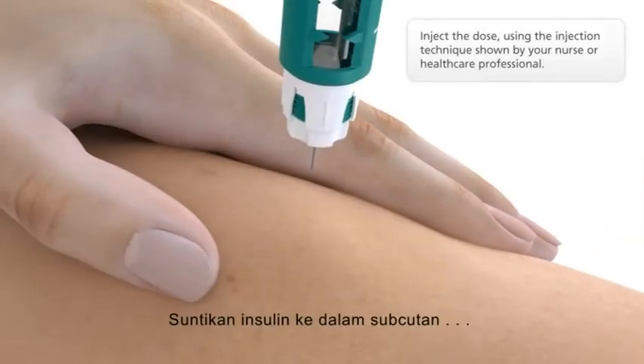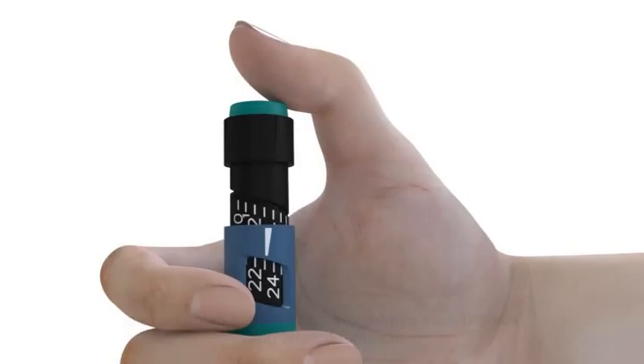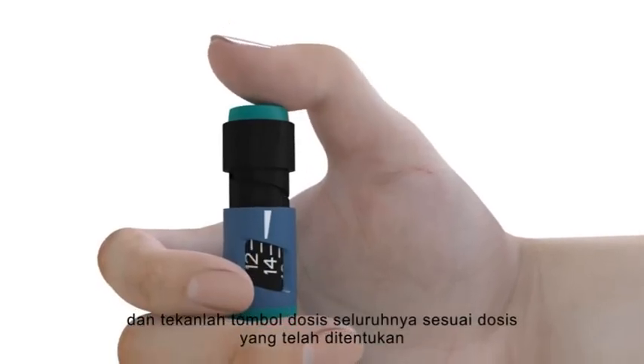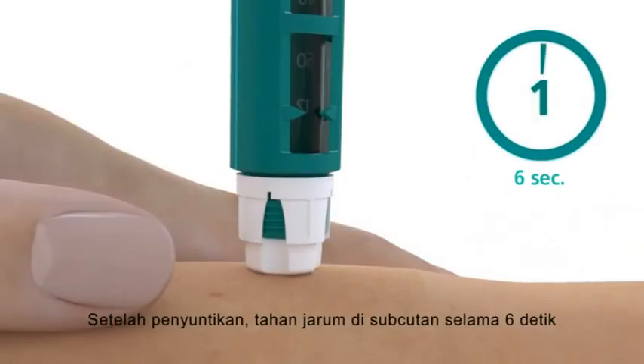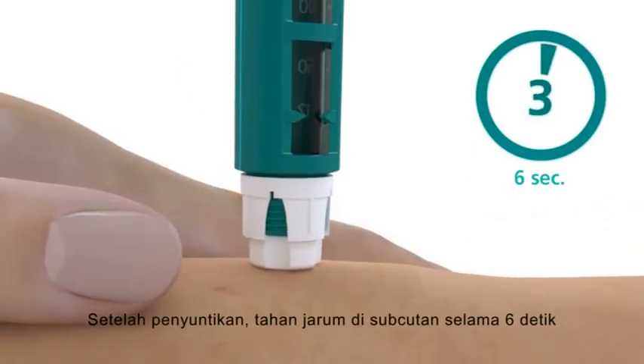Insert the needle into your skin and press the push button all the way in to inject your dose. After injection, leave the needle in the skin for at least six seconds.